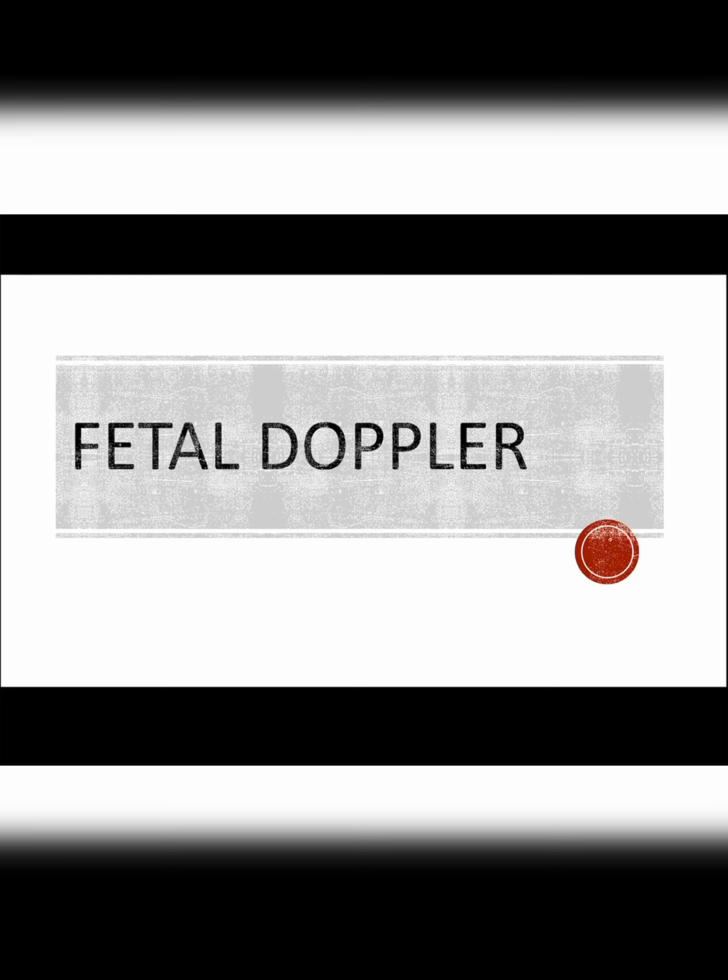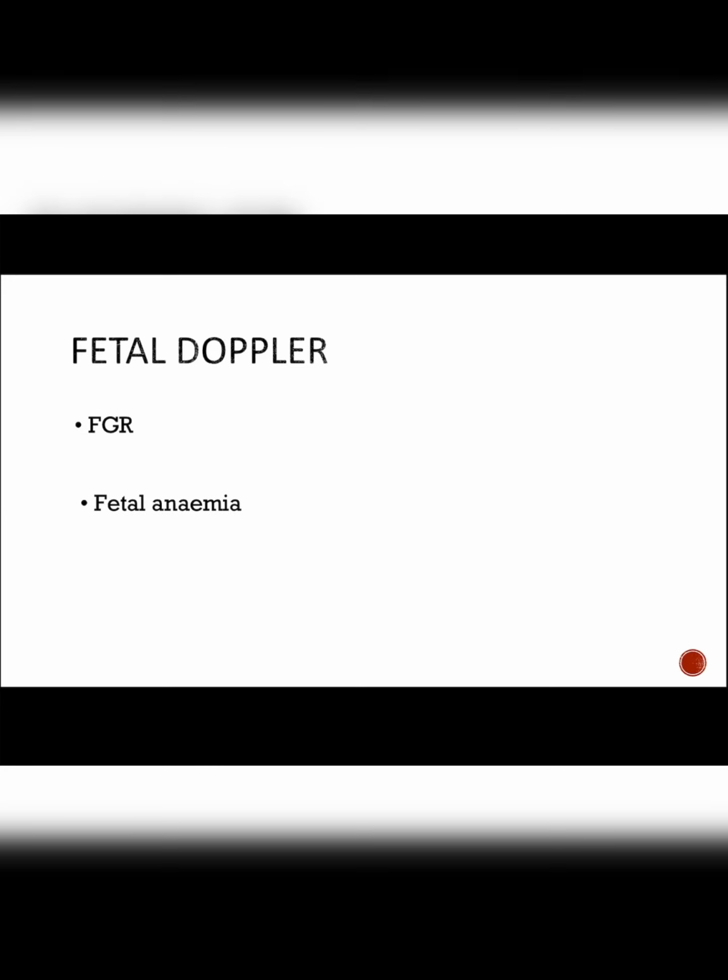Hi all. So let's start with fetal Doppler examination. So what is fetal Doppler? It is like we are assessing the blood flow passing through the placenta. So there are many arteries involved. There can be a uterine artery, there can be an umbilical artery. You will read about further that there's involvement of the fetal middle cerebral artery and the ductus venosus of the fetus.